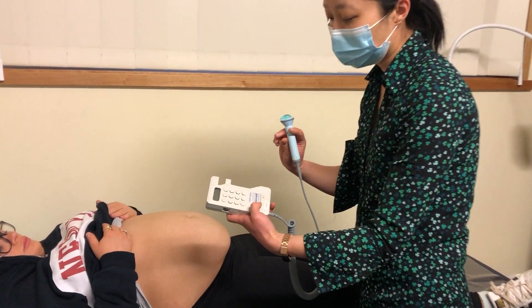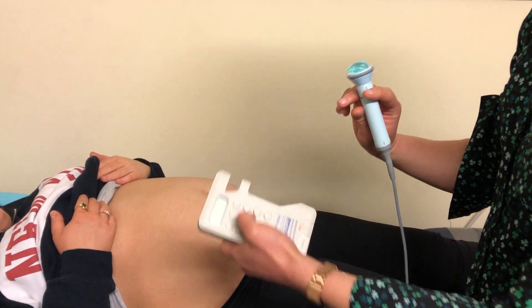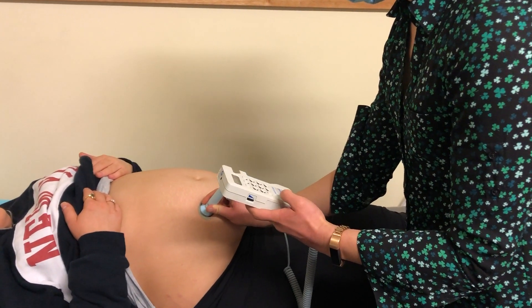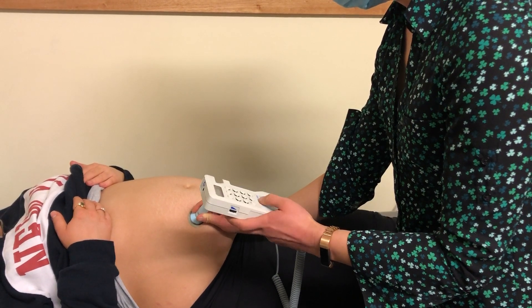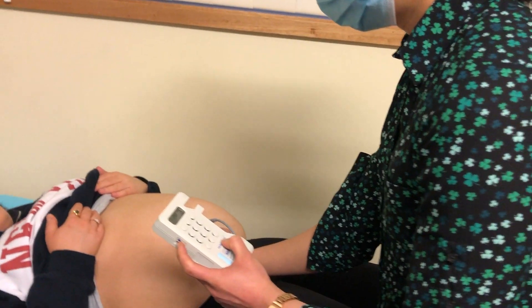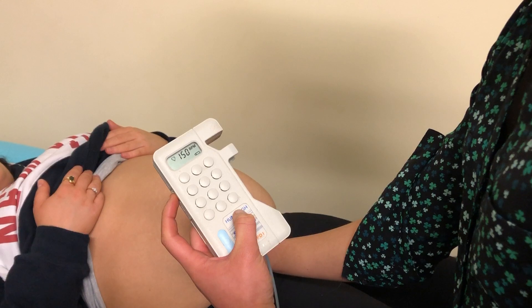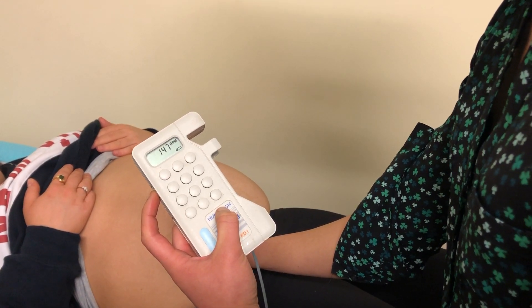The Doppler has an on and off button, and some transducer devices will have a display. Some devices also have a volume setting control. We can see the display there — the fetal heart rate is normally between 110 and 160 beats per minute.